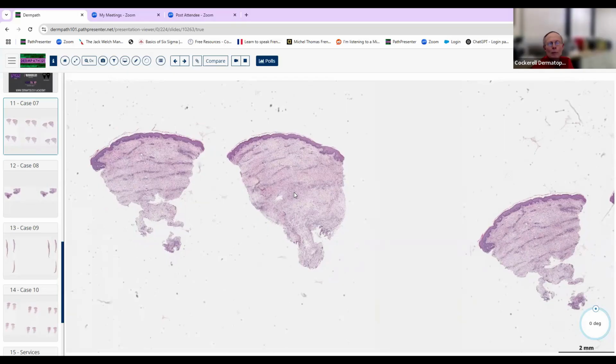So inflammatory, not neoplastic. And what's the pattern? Well, there's some perivascular inflammation up here that's pretty sparse, but the dermis is not totally normal between those little aggregations here. So there may be some interstitial and diffuse inflammation also. There's not much fat in the biopsy. It's pretty deep. So it went deep enough to get to the fat, but we're not really seeing much fat.